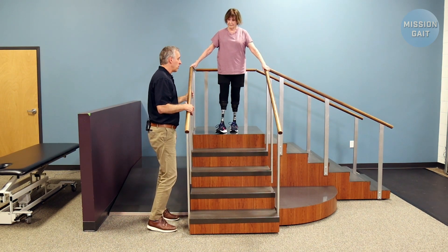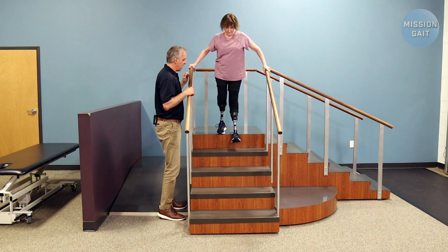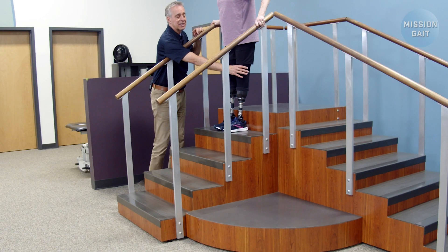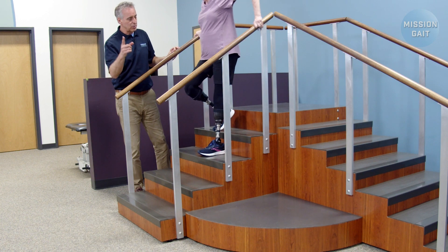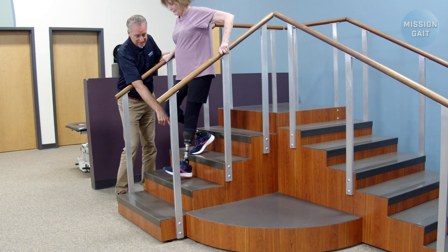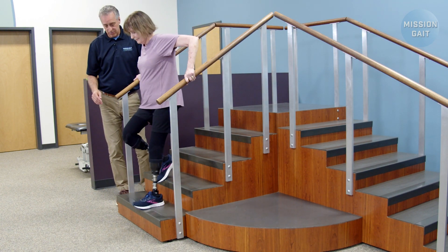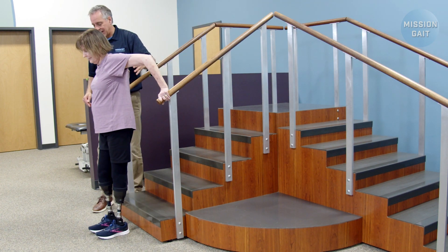Coming down — if you're going the same way with bilateral railing, what she wants to do is step forward with either foot and bend. Notice how she came down pretty quick. What I'd like her to do is take a second to get this leg nice and straight underneath her. Step down, get your weight all the way on top of it, then step down. Notice how she hangs that foot a little bit off the edge of the step, just to get a little more clearance so she doesn't drag the prosthetic coming down.